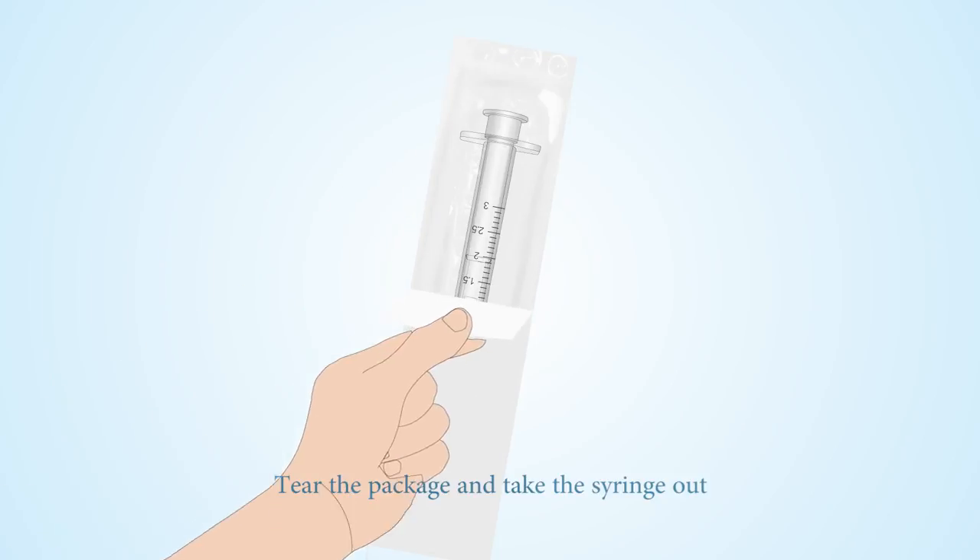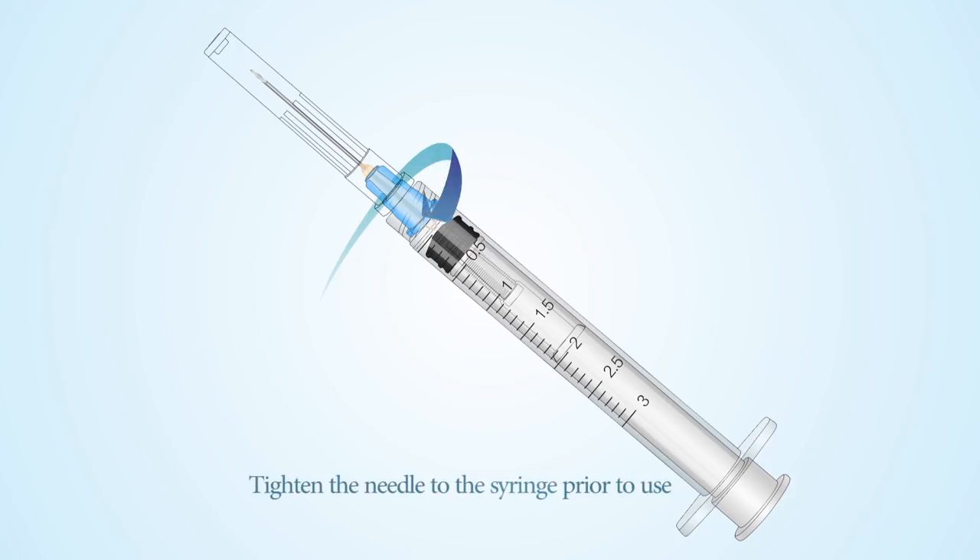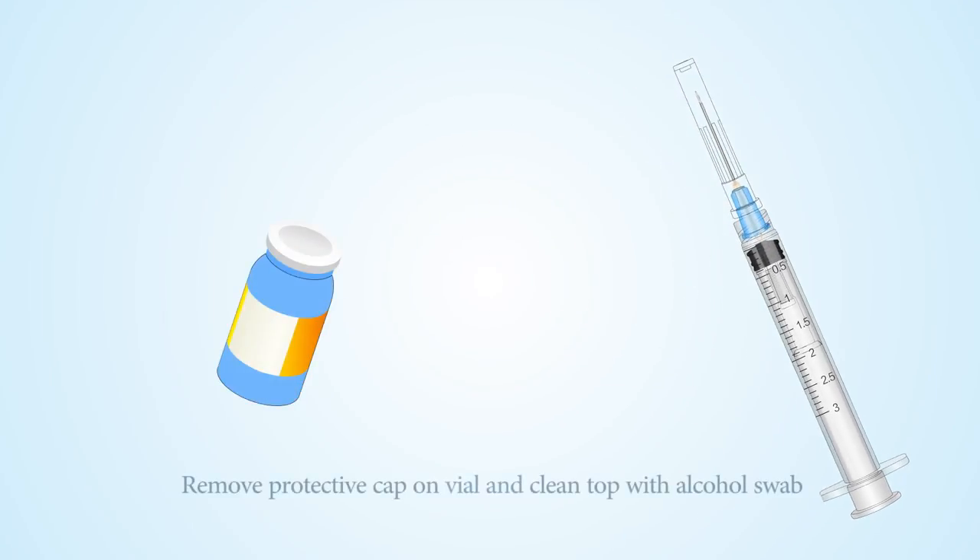Tear the package and take the syringe out. Tighten the needle to the syringe prior to use. Remove the protective cap on the vial and clean the top with an alcohol swab.